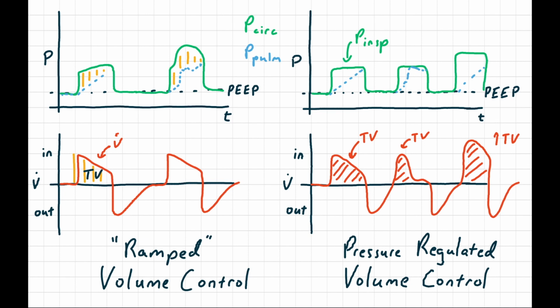Now I draw all this out not because it's important to think, what if the patient coughs every time you put one on a ventilator, but because thinking about these different scenarios can help you understand your ventilator modes in general a little bit better.